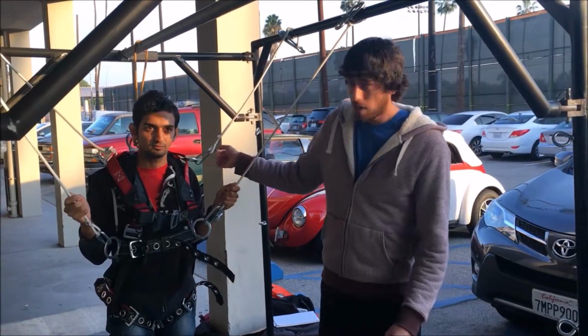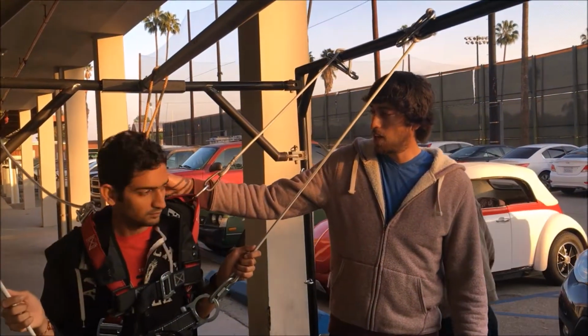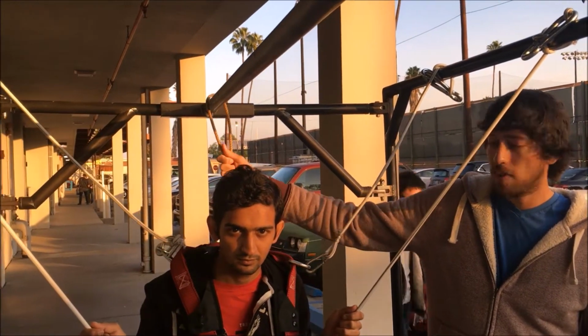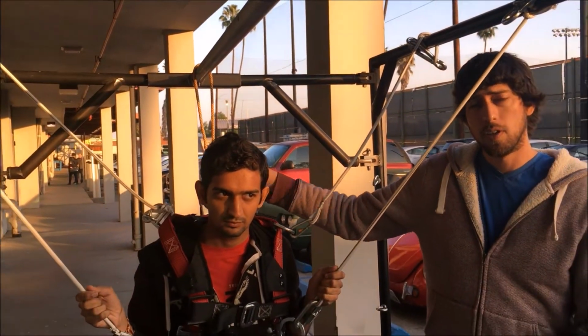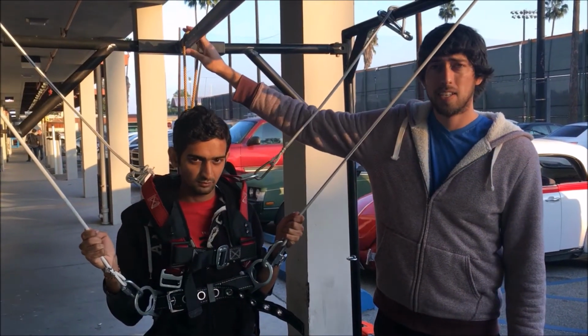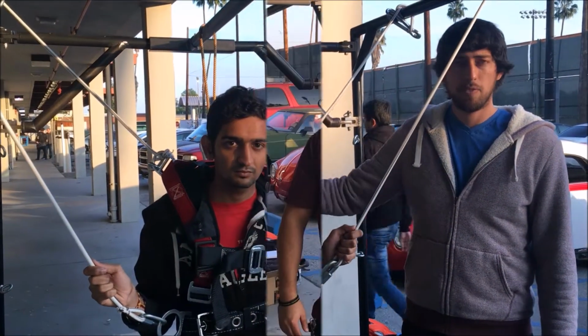And finally, one of the other main features of this harness is that it has a support in the back here that can prevent the patient from falling if he were to fall all the way to the ground. As you can see from here, you can go ahead and connect another rope and then prevent it from falling.